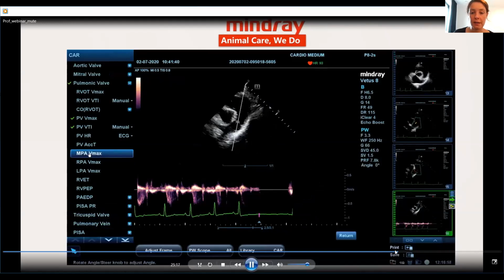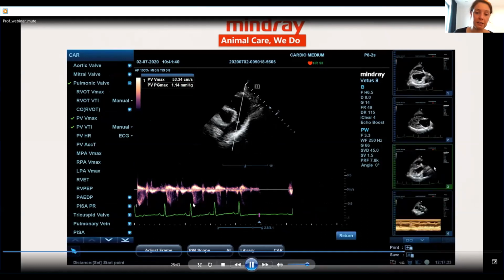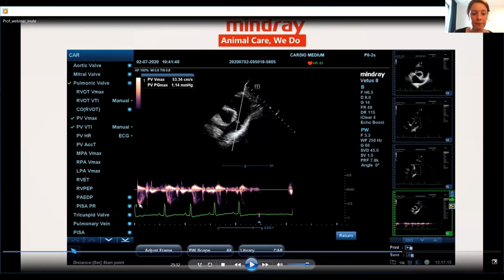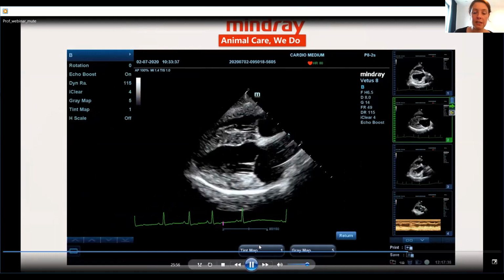Let's move on. So this is the pulmonary artery velocity measurement. Here you see the pulmonic valve. This is the bifurcation, the right main pulmonary artery and the left main pulmonary artery. And this is our pulsed wave measurement. So you go to the pulmonic valve, and there you see the pulmonic velocity, Vmax, and you can measure the velocity. Important for this is that you don't measure all the way to the end of the little feathery edges. Wait, I will just go back for a second. You measure where your signal is delineated best. If you have these feathery edges, these profiles are not very good, but sometimes you still have some edges here. You don't measure all the way down, you measure where you have a well-delineated signal.